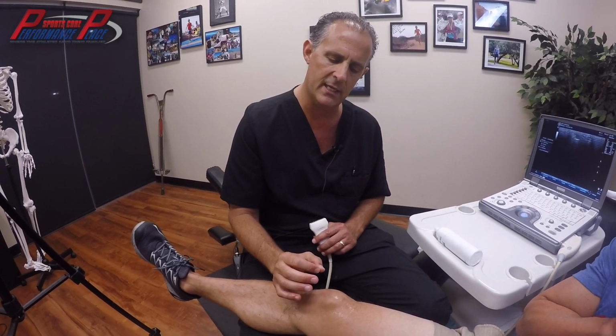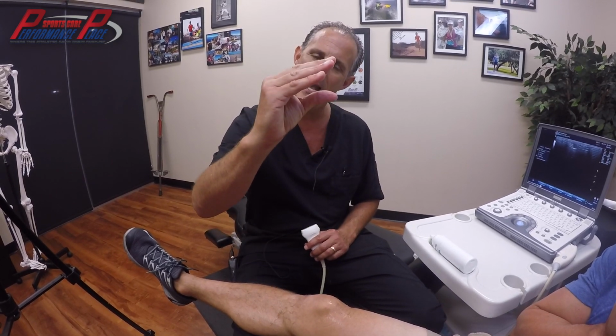Now the x-ray can miss things too. We're finding more and more that sometimes at off angle, you can miss little things even on an x-ray. The next thing I'd want to see on the x-ray is how does the spacing look behind the kneecap? Because an x-ray shows that really, really well. You can see how diminished the space is, or is it bone against bone, or is it wide open? So you get a little better perspective of that.